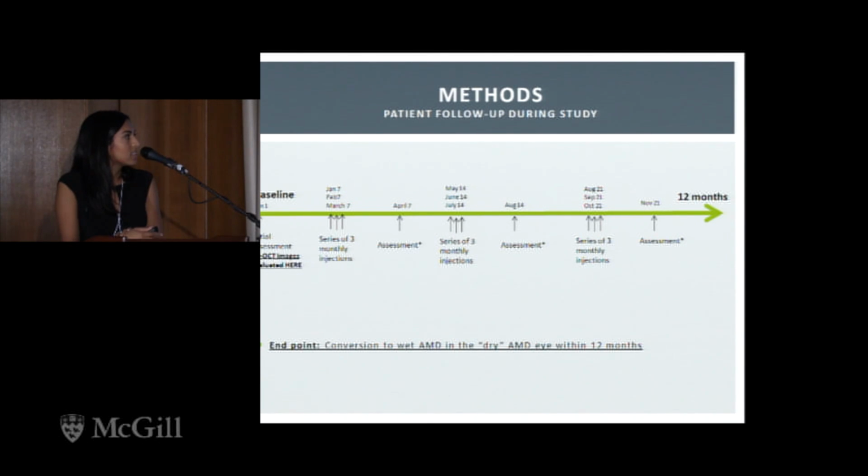This slide is essentially showing that because these patients had wet AMD in the contralateral eye, there were several checkpoints from the time that we first looked at the OCT image in the dry AMD eye to the 12-month time frame where we could have picked up whether that eye had converted to wet AMD. This allowed for some consistency in our ability to monitor these patients, even though it was a retrospective study where we usually don't have that ability.